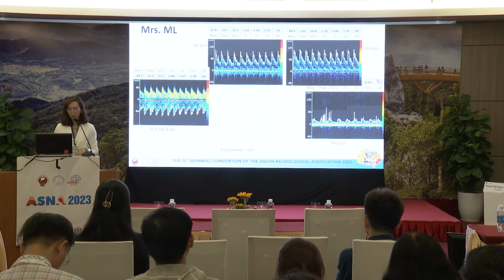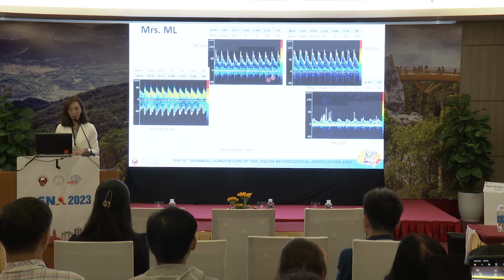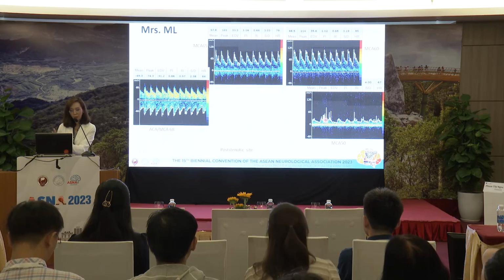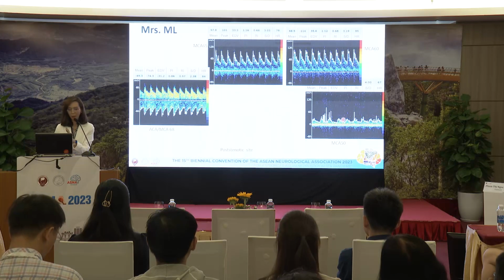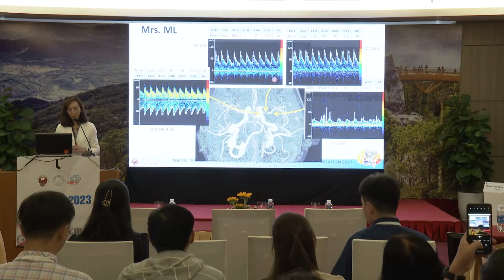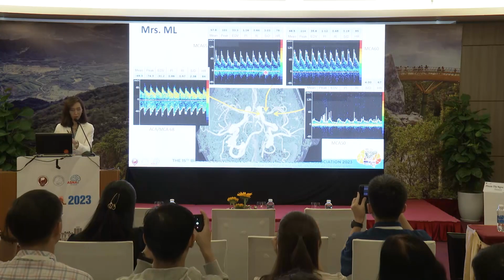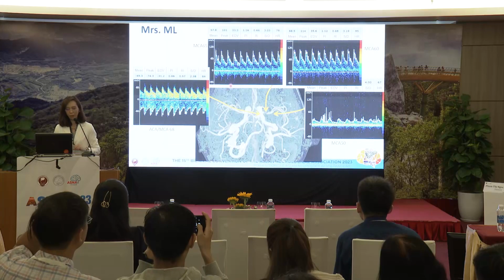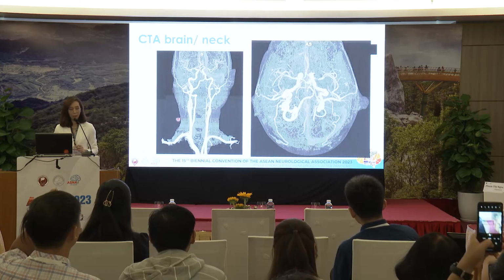So the probe is right somewhere over here. Getting deeper, you can see that this is ACA and this is MCA. And the velocity is very high in the MCA right at this point. And going near the probe, the velocity is down and the wave looks dampened or attenuated. So this is what the CTA looks like. At the stenotic site, usually we'll get a very high velocity, and we should measure that and see how high the velocity is, and you can just go to the criteria and look for it. So this patient is having MCA stenosis, and the carotid is fine.